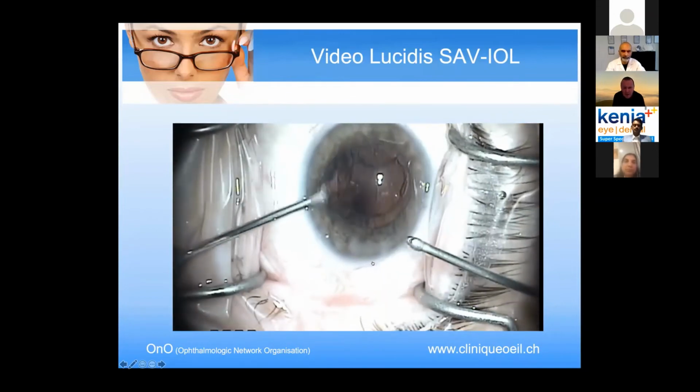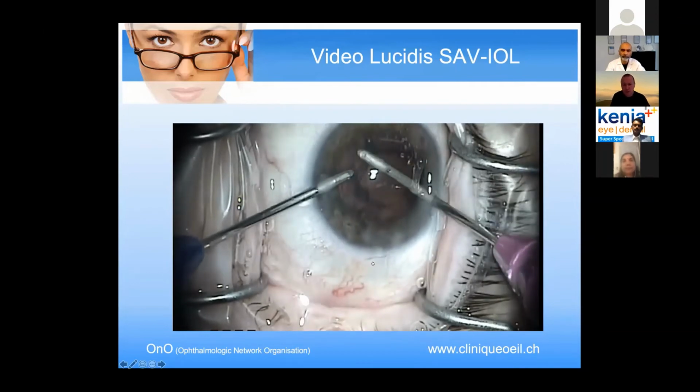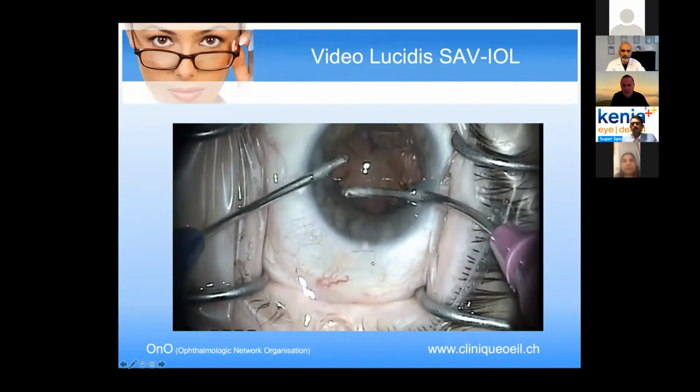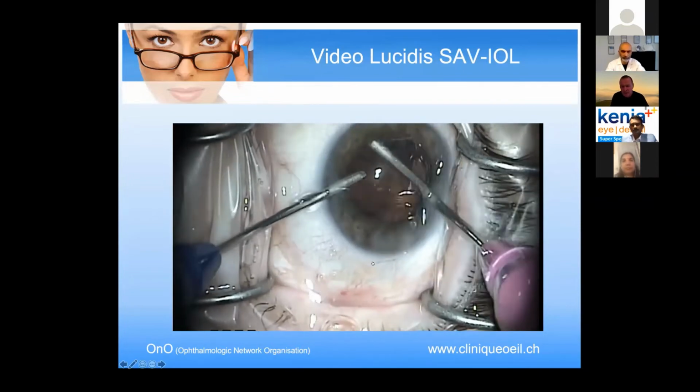And then I use the bimanual irrigation aspiration from Bovet, and that's not a big problem. And I take out the cortex.